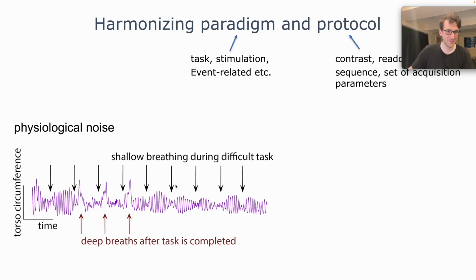And you can see certain features: always when there's a black arrow, the respiration almost disappears, right? So they really focus and think about it and almost forget how to breathe, right? Which obviously has an effect on their oxygenation level in their vessels. But in some cases, like here, you see that they focus, they almost don't breathe, and then they press the right button and they breathe in and out and are relaxed, right? So this can really result in artifacts.